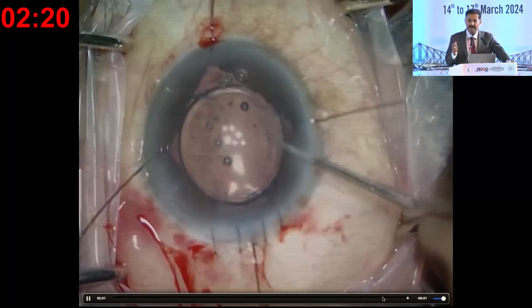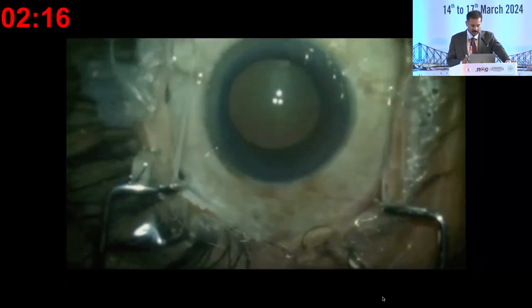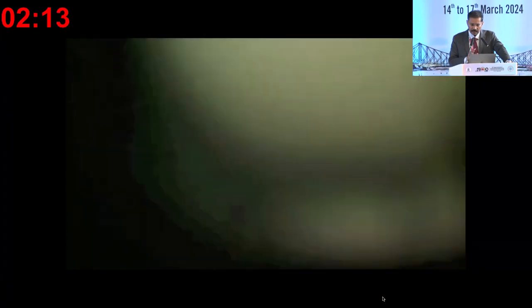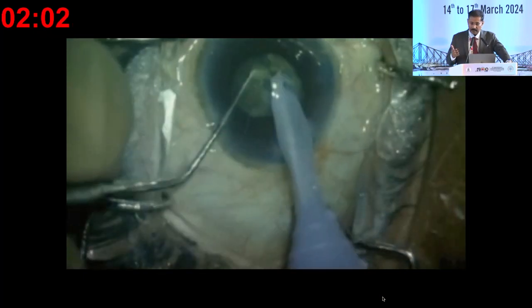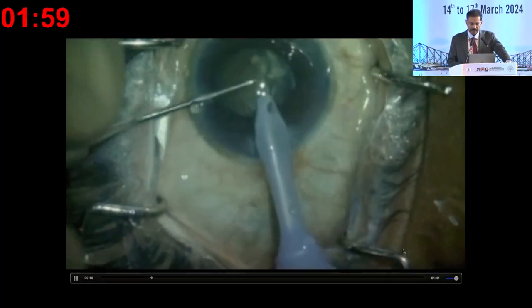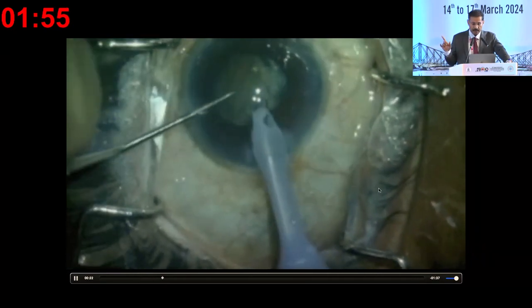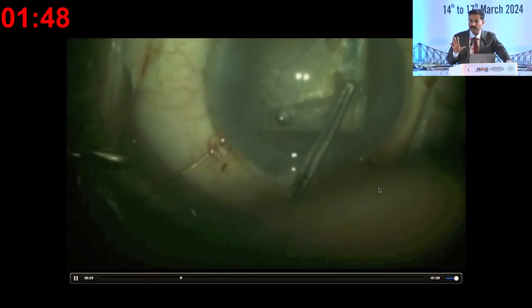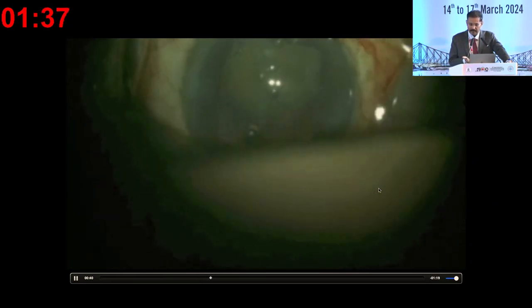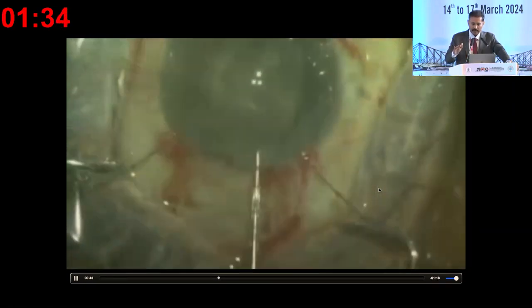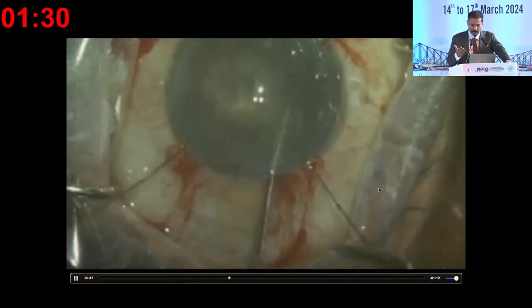Some lenses now with 13.5mm overall size fit well. This last case was done by a trainee. The rhexis is very small, so a forceful hydro is done — you can see a pupillary snap already, and now further hydro dissection is happening without realizing it. You can see a very clear area and now the rotation of the nucleus stops. You push, it goes to one side, it doesn't spring back. So we take over, dilate the pupils — that's the first thing to do. The rhexis is small, so we extend it, retaining as much intact rhexis margin as possible. This is a full nucleus, tilting, but with viscoat going underneath the lens you can dial the nucleus out into the anterior chamber.